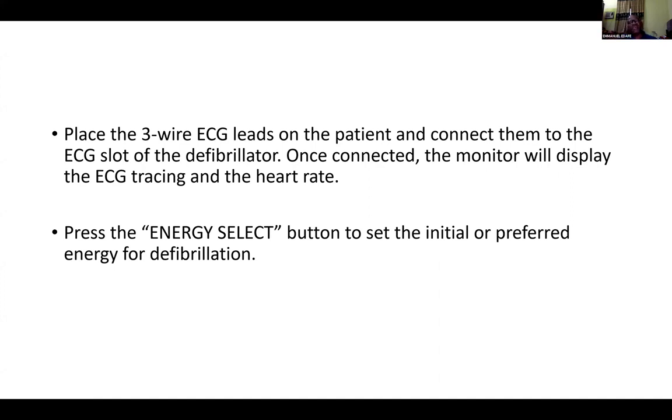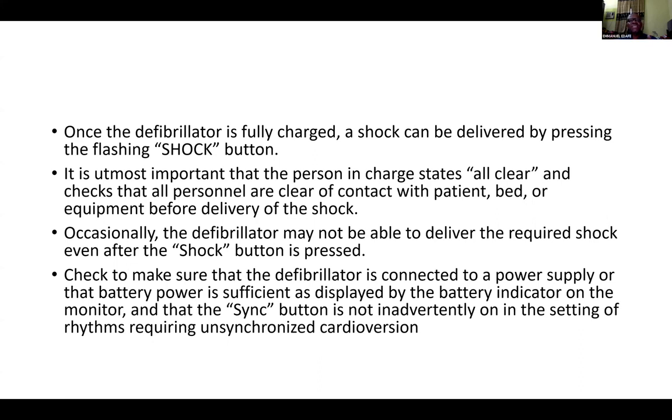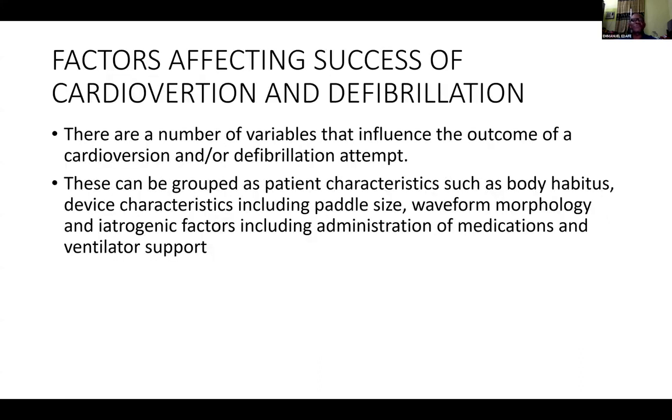How do you know that the synchronization is on? It gives you a dot on top of the R waves. Then after that, you press your charge. Once the charge is complete, you go ahead and cardiovert. But in defibrillation, you don't synchronize. So that is the pathway that we follow.